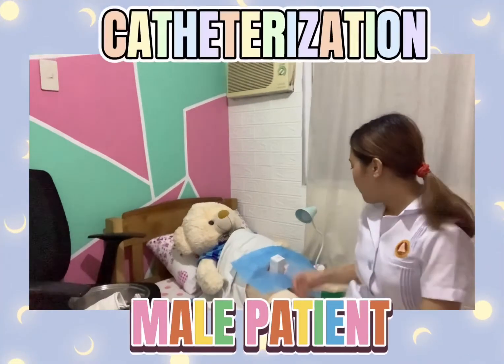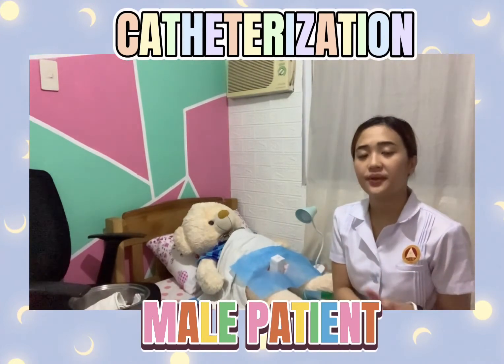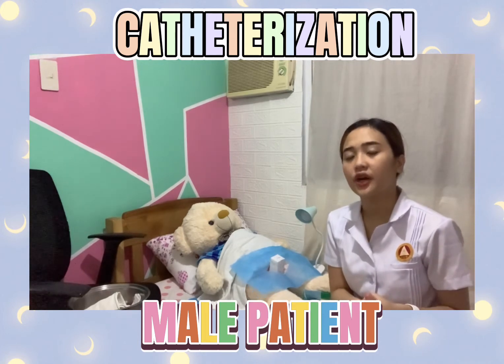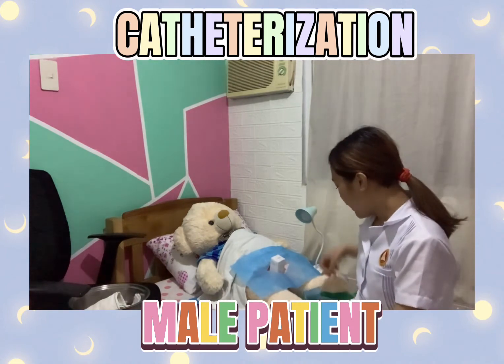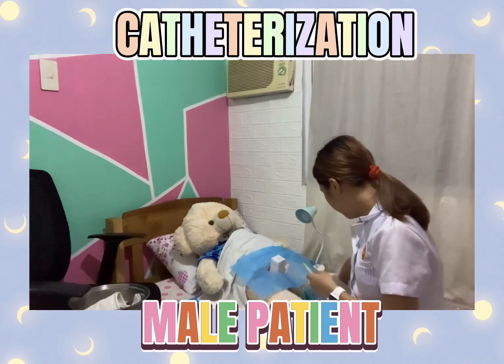Okay, so for our male patient, assume that we've already finished the female patient. Now we will proceed on administering the catheterization for male patients. Again, with our catheter, we will lubricate it.